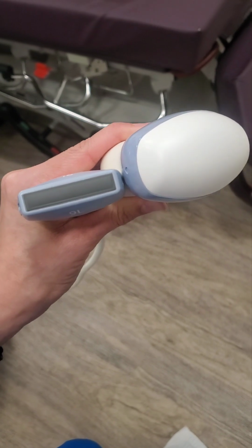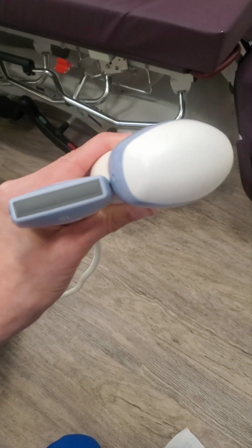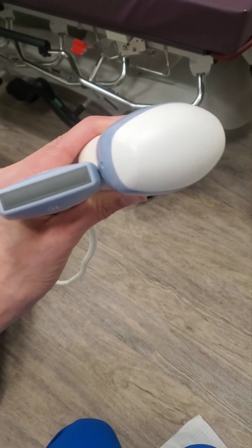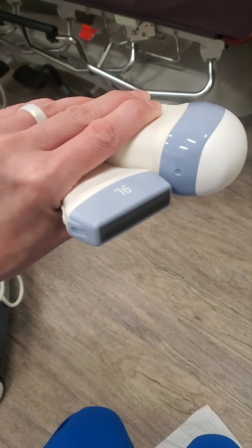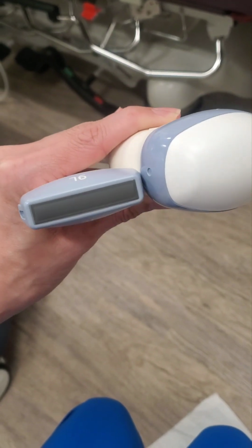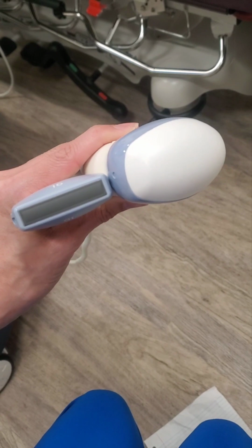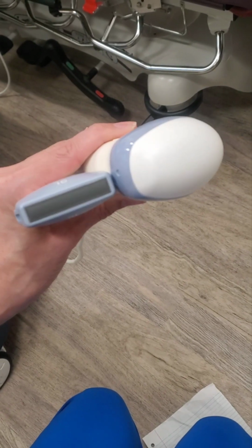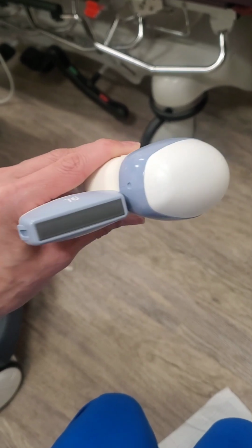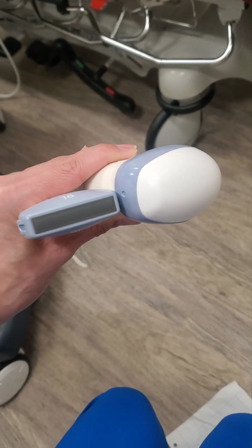And I'm holding this transducer as well because if you look at the height of these faces, which one has better elevational resolution? Which one can you do 3D with? Right, so when you're talking about the resolutions, you can also think about the shape and the structure and the function of the transducer itself. So you'll have the best elevational resolution if you have like a 1.5D or 2D array transducer.